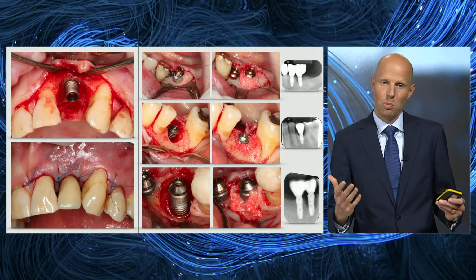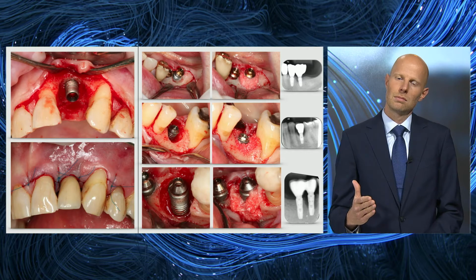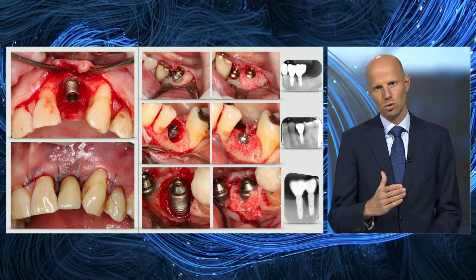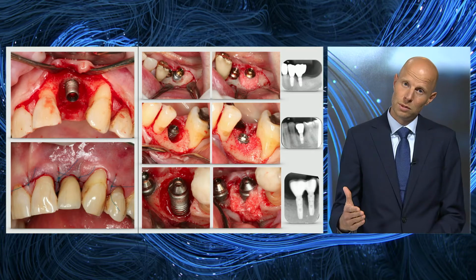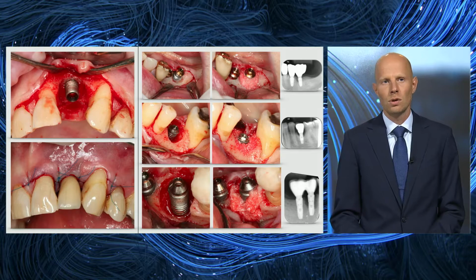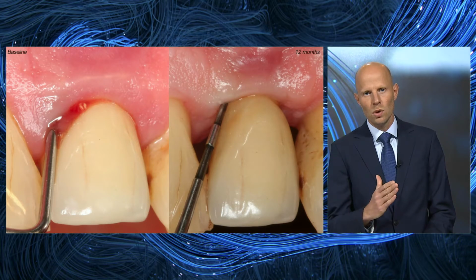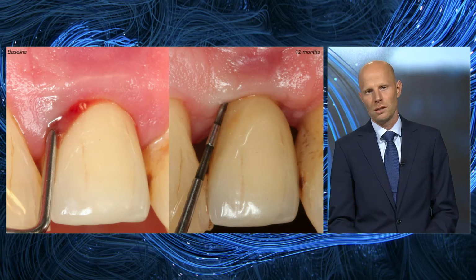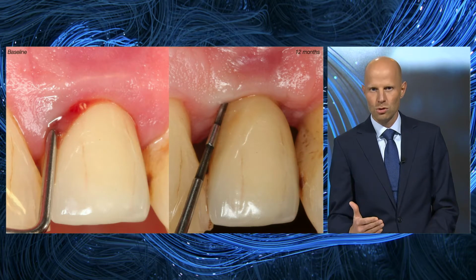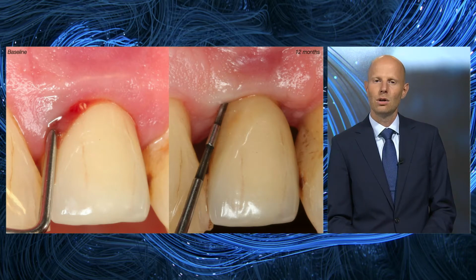Then, according to the periodontal protocols that we have, we follow our cases. Plaque control is re-established by the patient, and then it is reasonable to probe at 6 and at 12 months, and a radiograph should follow not earlier than 12 months. So it is a case like this, indicated now by the picture, where we initially have deep probing exceeding 10 millimeters. We achieve a pronounced reduction of the probing pocket depth, and I will add the radiographic image.